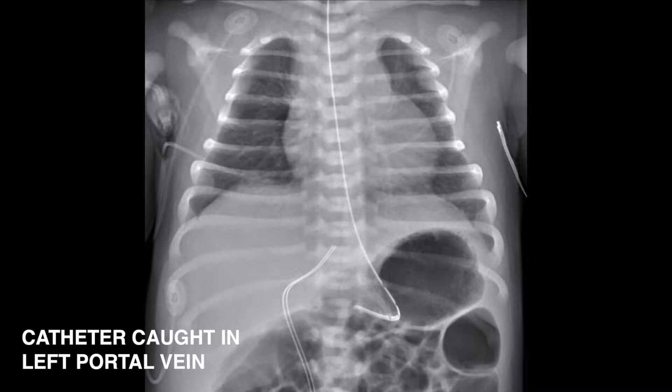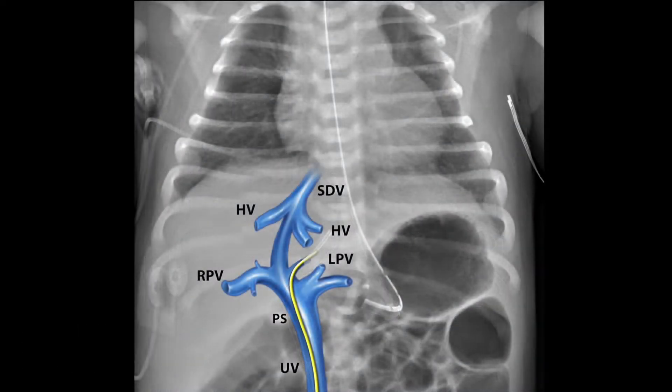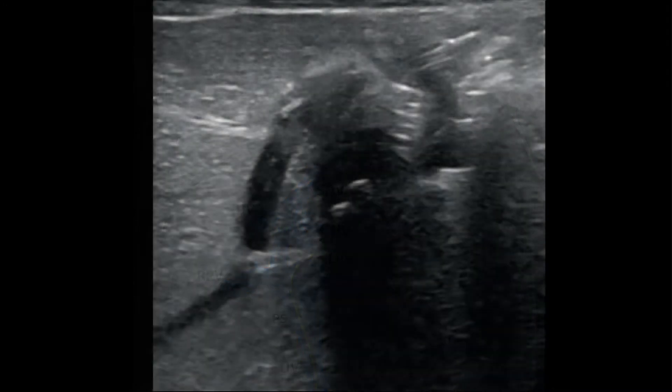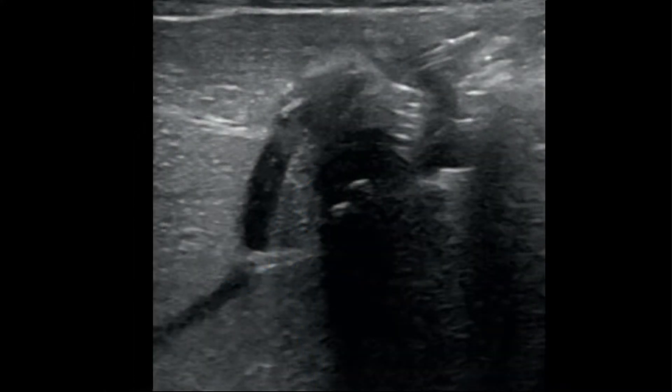Here is a radiograph of a UVC malpositioned in the left portal vein. The overlaid illustration highlights the anatomy. Portal veins may be distinguished by their echobrite endothelium.